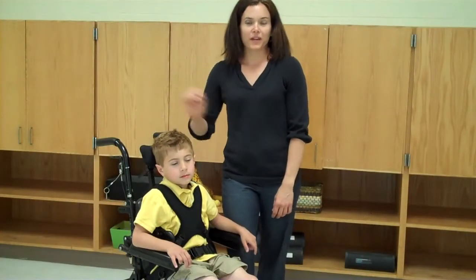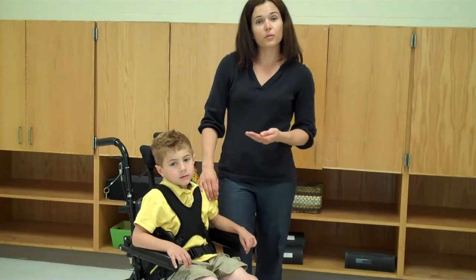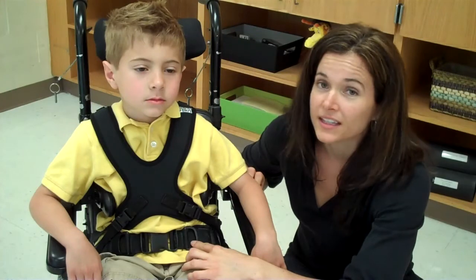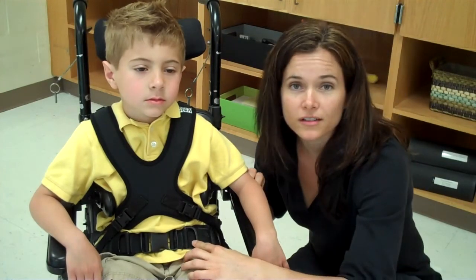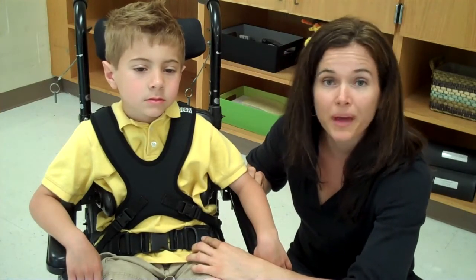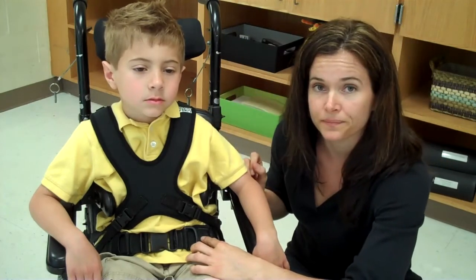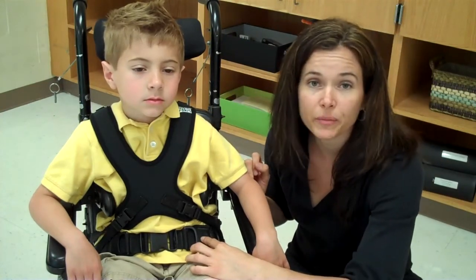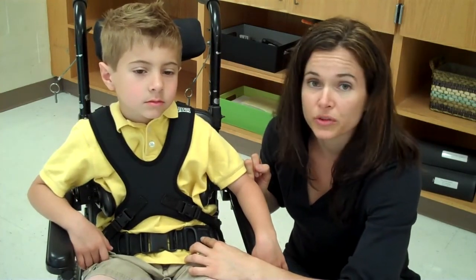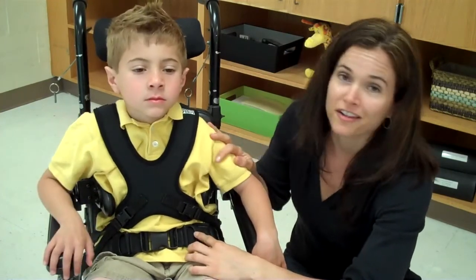I'd like to introduce you to Quinn, and he's going to be helping us today. First, I'd like to introduce you to some common wheelchair parts and how to manage them. This is the pelvic positioning strap. It is not a seat belt. Seat belts are in cars. The pelvic positioning strap helps keep the child's hips positioned back in the wheelchair seat. It also helps the child to maintain a functional upright position. The pelvic positioning strap is very important because with mobility during the school day, if the child or the person pushing the wheelchair were to stop suddenly, the pelvic positioning strap is going to keep the child safe.